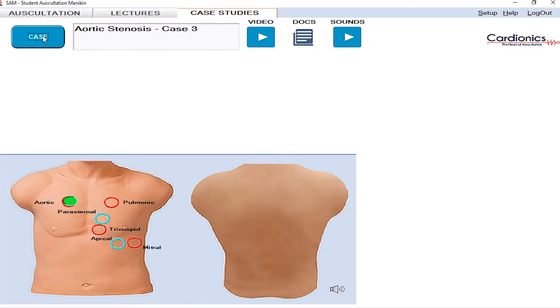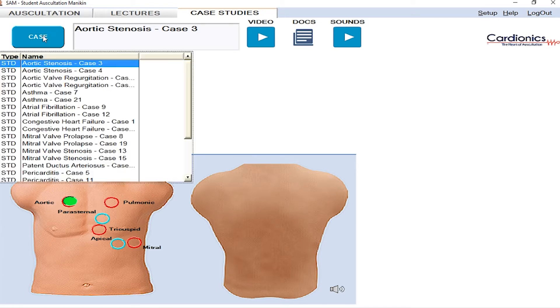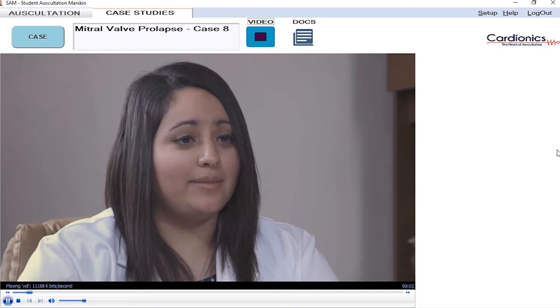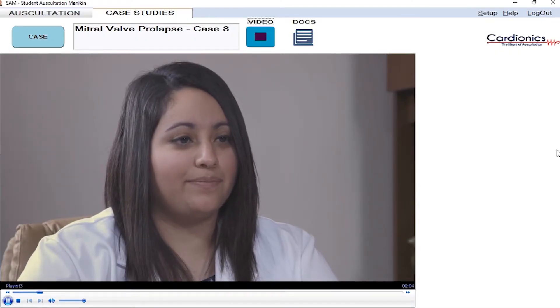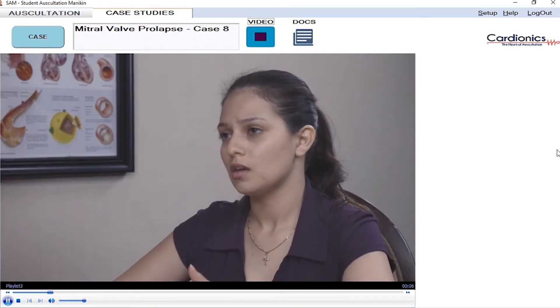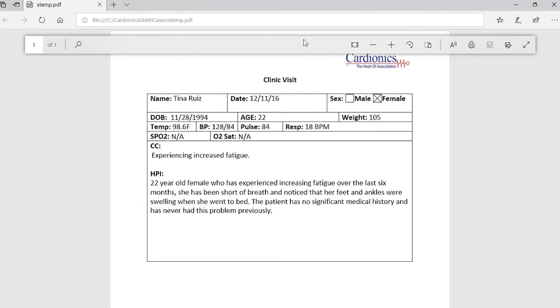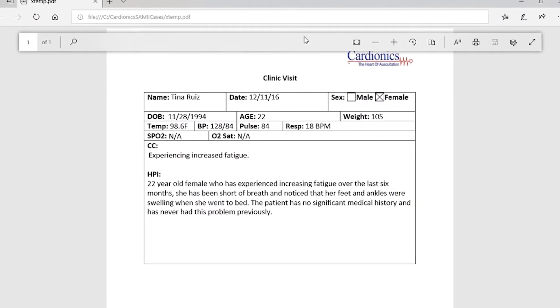The final tab is case studies. Here you will find a library of 24 videos which include simulated scenarios between healthcare provider and patient. You can also create and upload your own case videos tailored to your specific curriculum. Click play to watch the case video, or click play sounds to follow along with the assessment. Each case study contains documents such as medical charts for each patient.